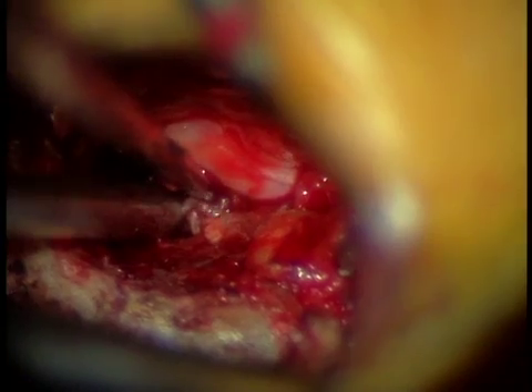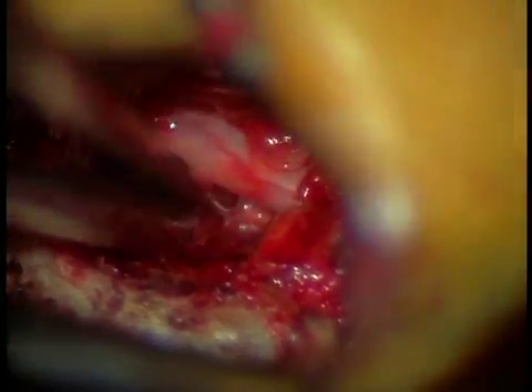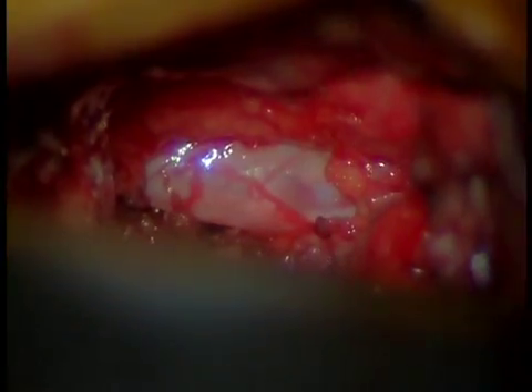Once we pull it out of the canal, as you can see, the nerve has substantial relief of pressure. Here as we grab it we can pull the fragment out, and here you can see how large that fragment is. The nerve is now decompressed from removing the fragment. There's always a hole in the back of the disc — that hole is the egress point for this herniation. We reach through that hole and remove any loose fragments that are still within the disc.